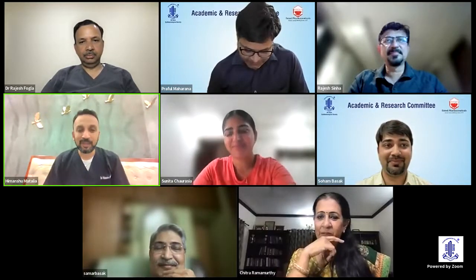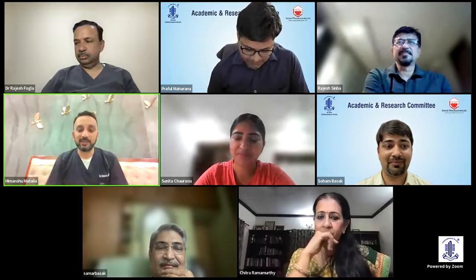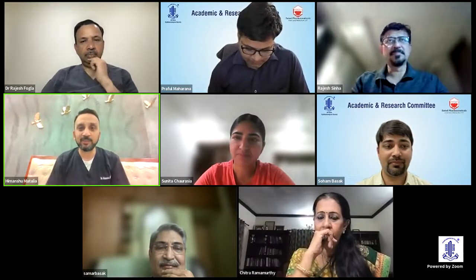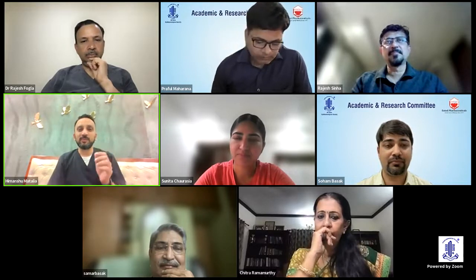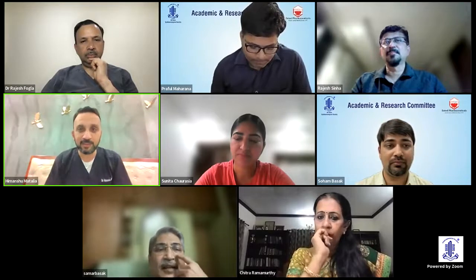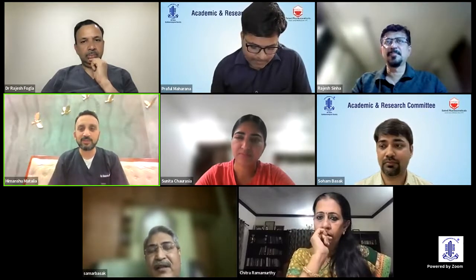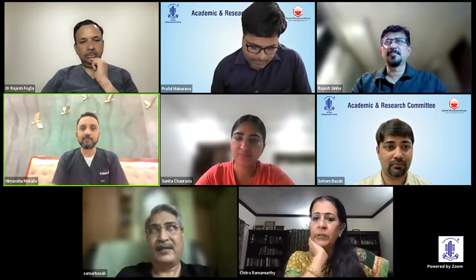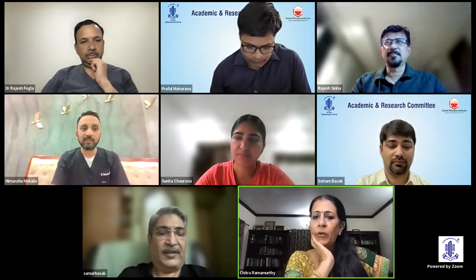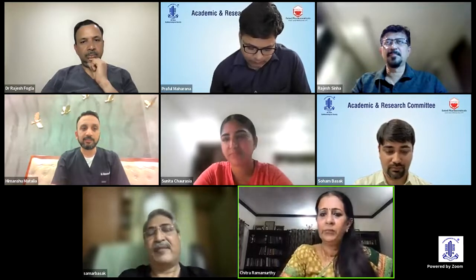So, Dr. BASAK, I remember you had presented a few years back in Reshmi Award, those small bubbles which you expand, which you go deeper. Can you elaborate a little bit more? You're muted, Dr. BASAK. You have to unmute yourself.